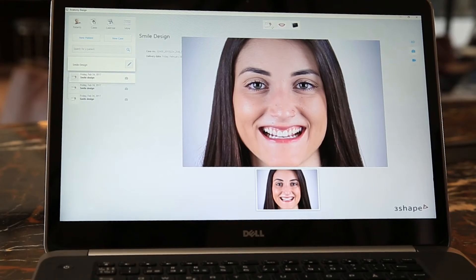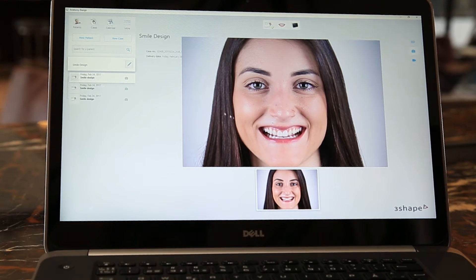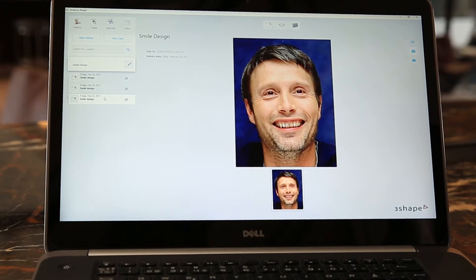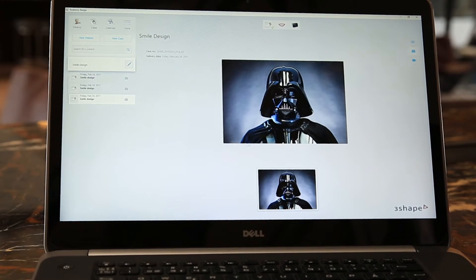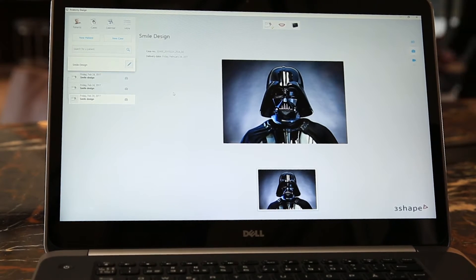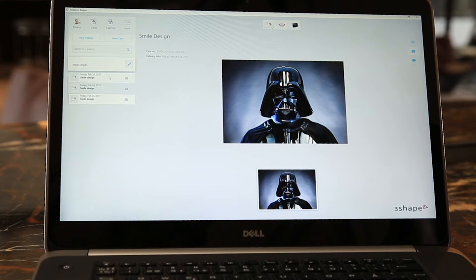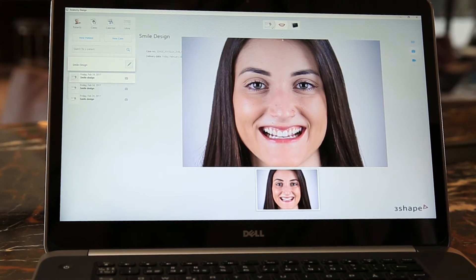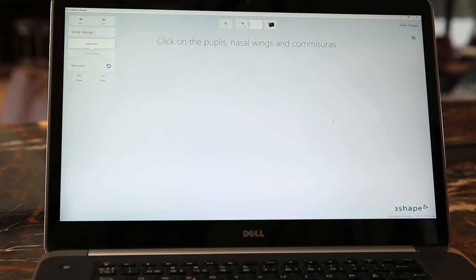Smile design works on 3Shape's new platform. Here I have my patient view and my list of patients. I'm going to go in and open the software with this girl here.